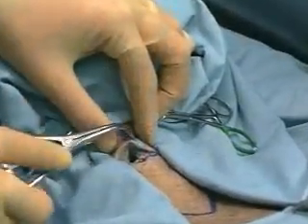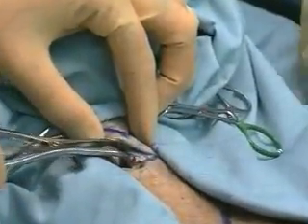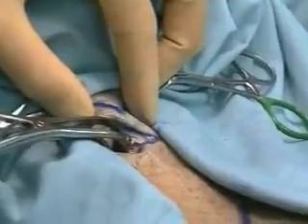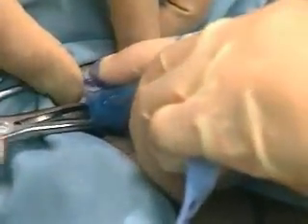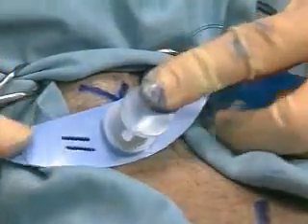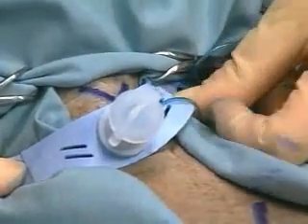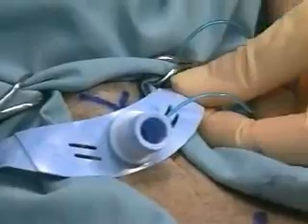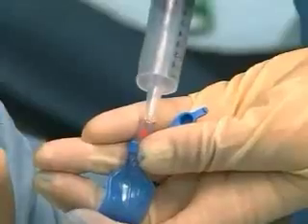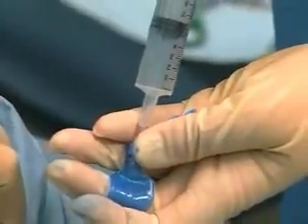With the tracheal spreader in place, insert a tracheostomy tube and remove the tracheal spreader. Alternatively, a small retractor can be used if a tracheal spreader is not available. Inflate the cuff with 5 milliliters of air.